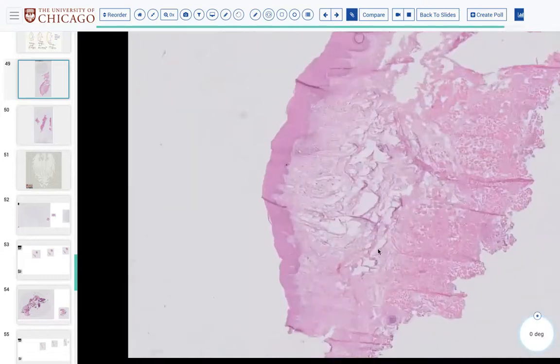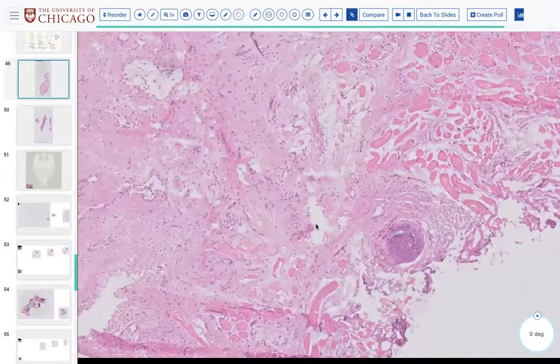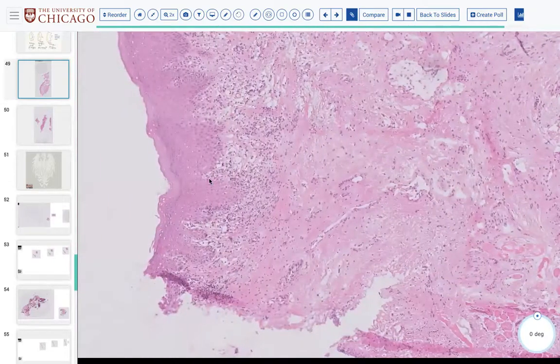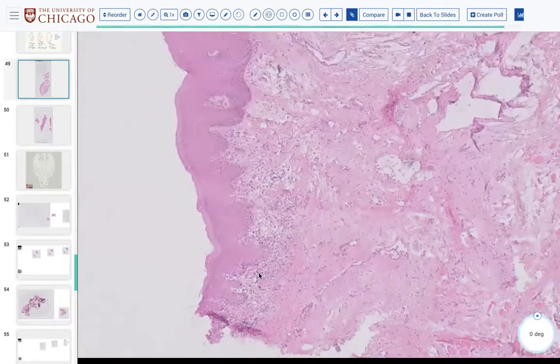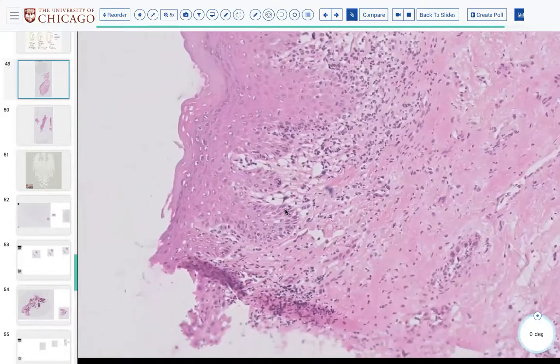No volunteers. Maybe if you want to do it in the interest of time, just so we can get through maybe more of them. Good. Yep, that's fine. There's not that many. All right. So I'll just start at the surface and let you guys look, and you can tell me what you think.